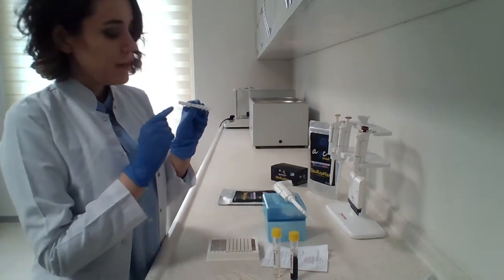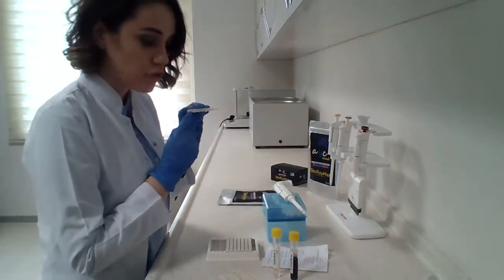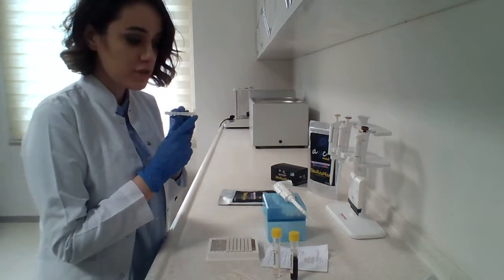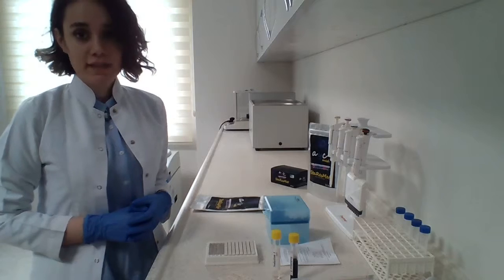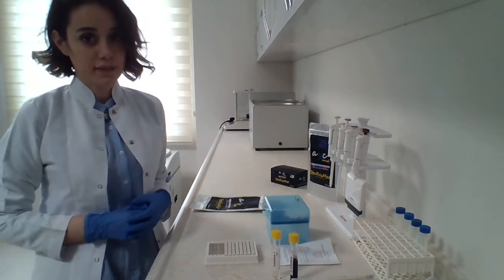On the strip, we can see the first well is the growth control well, and the last one will be the sterility control well. Now we added solution 1 to every well that we're going to use.